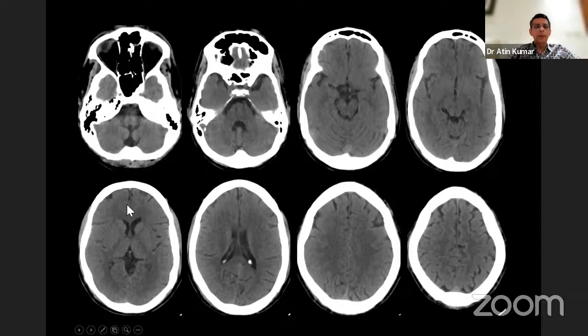When we're talking about the brain, this is what a normal CT imaging of the brain looks like. These are axial cross-sectional CT scan images, and we're going up. These are cross sections, let's say around 5 to 10 mm apart. This is from the base of the skull, then we are going up cranially till almost the level of the vertex. As you can see, this white or bright part is the bone, and bone appears quite hyperdense on CT scan examination.